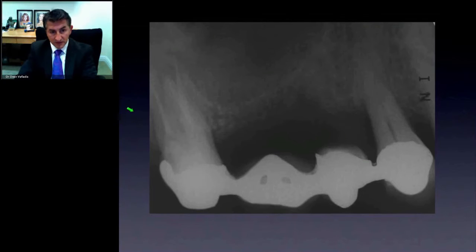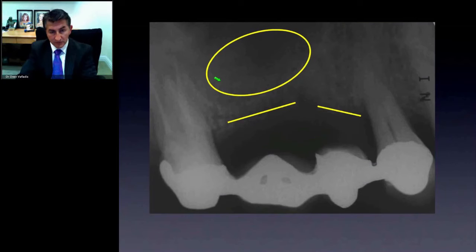In this patient, this tooth is a hopeless tooth. It's got a lot of infections. It's kind of hurting the patient. But if we take it out, we lose our whole chance of making it provisional. The patient's going to need bone grafting here, and after what we evaluate here, they're going to need bone grafting, then placement of implants. There's only 2 millimeters of bone there.